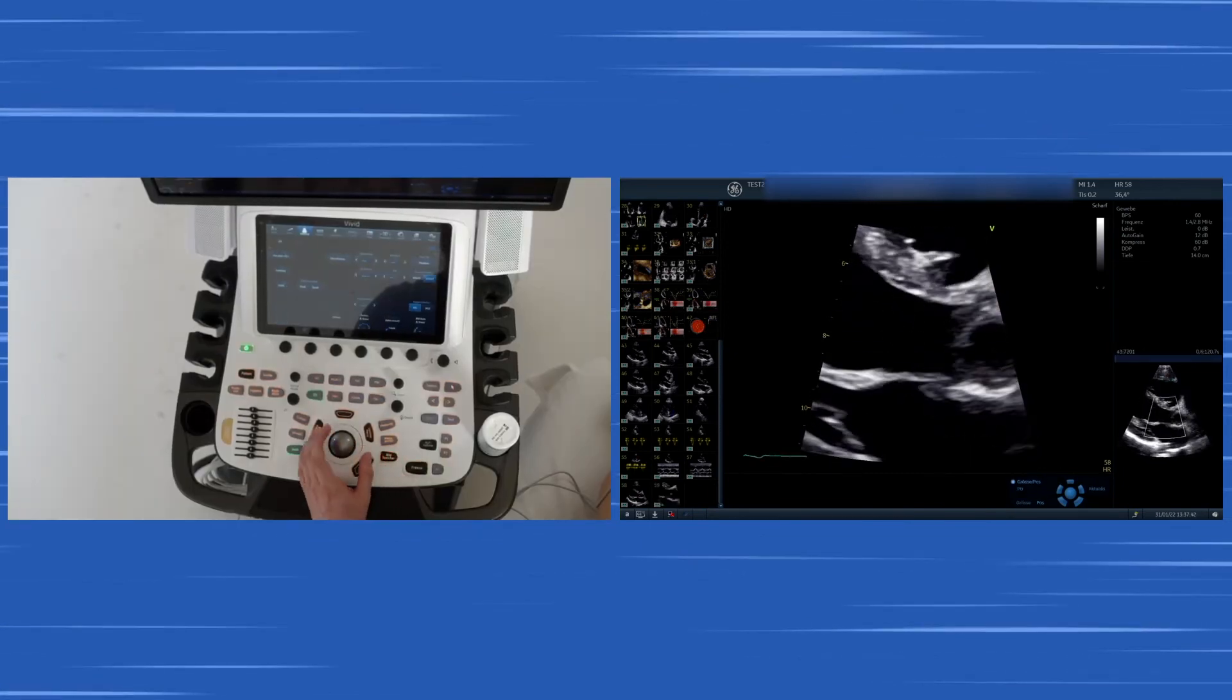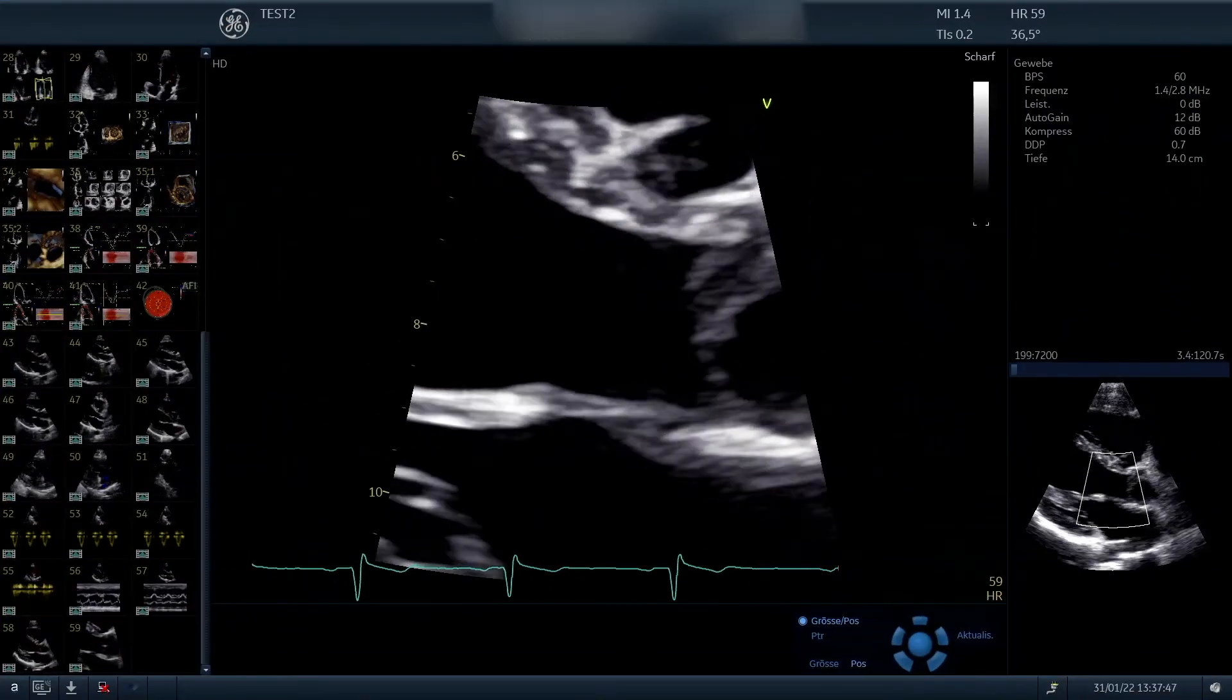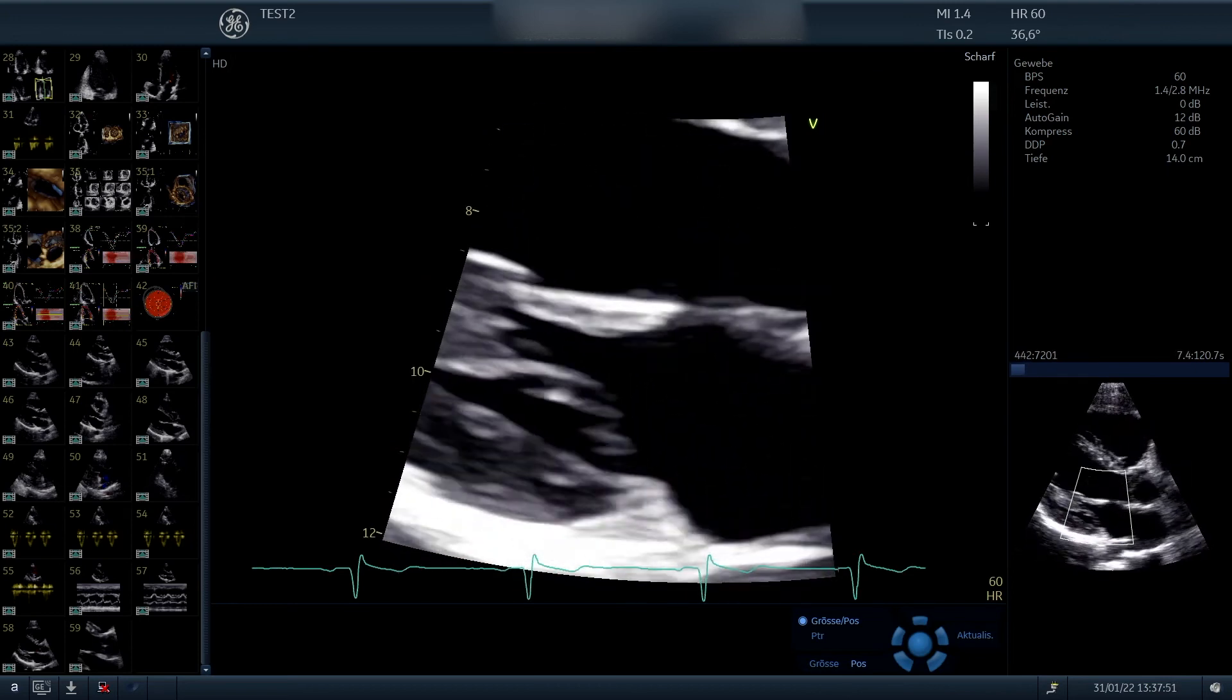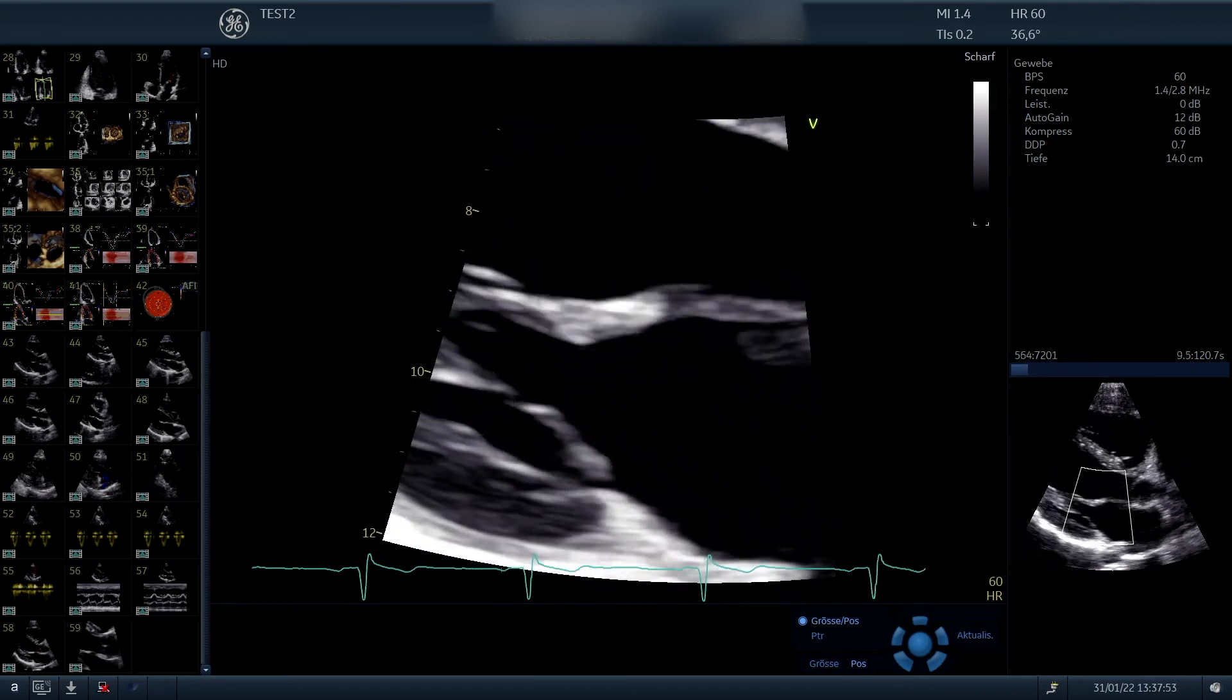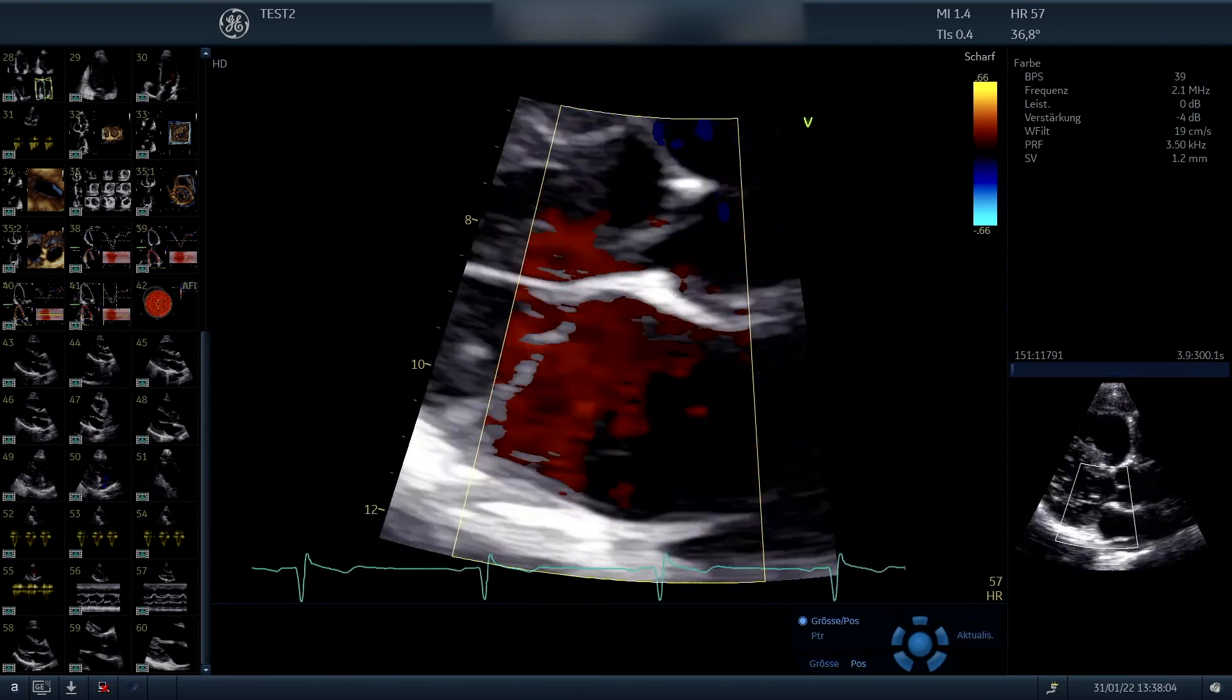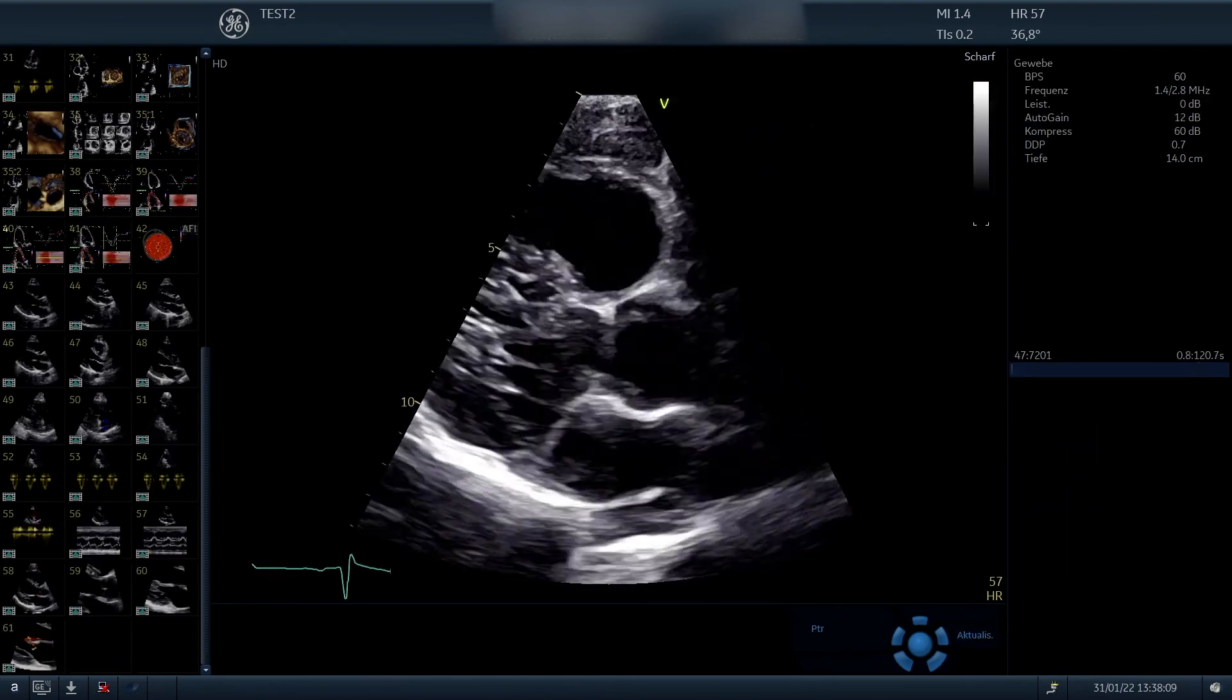We can also do that with the mitral valve and focus our view on the mitral valve, the anterior mitral valve leaflet upwards and the posterior downwards in the screen. And you can also add color Doppler in this setting after saving the image. And you can see where regurgitation by tilting the transducer might be located.